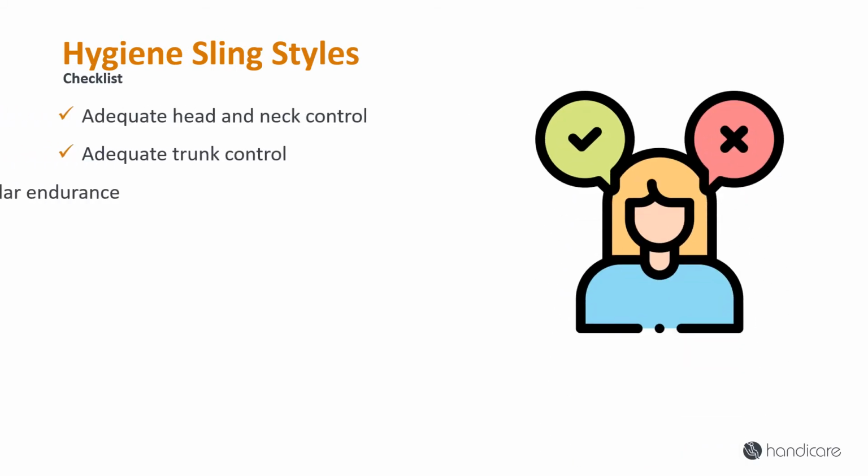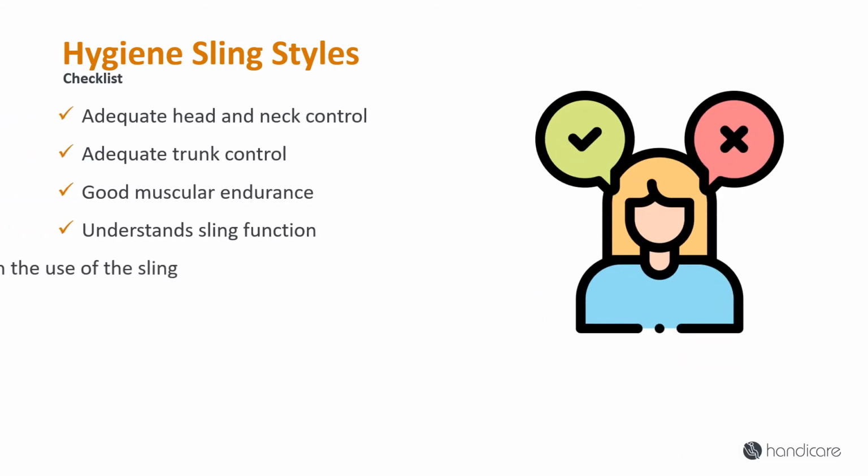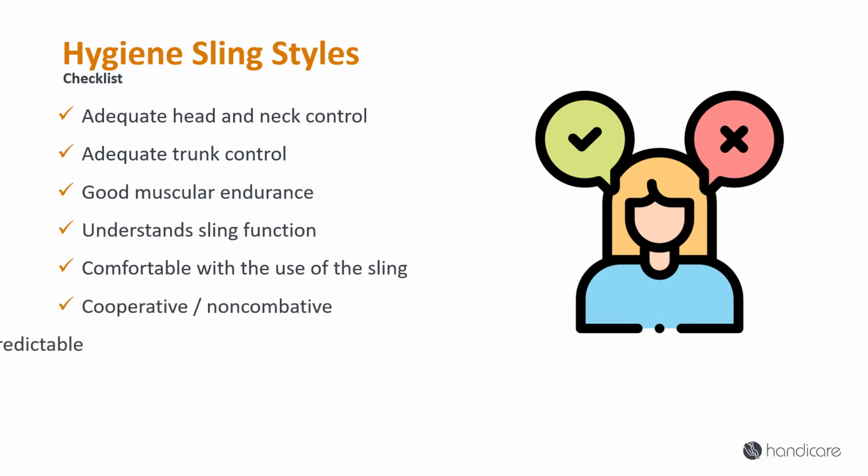Let's recap. When selecting a Hygiene sling style, the healthcare professional will determine via a thorough resident assessment that this sling style is appropriate and supportive enough for the resident to use safely.